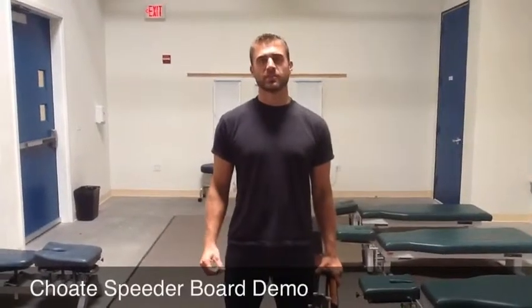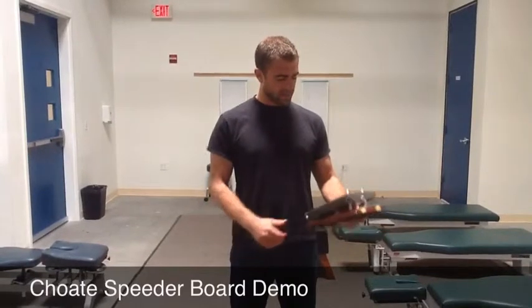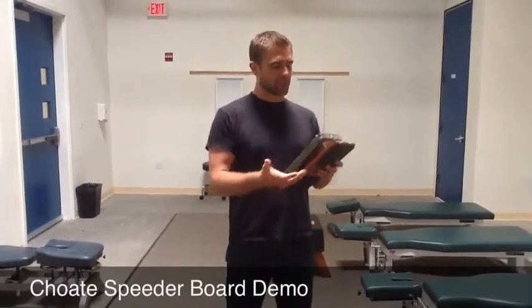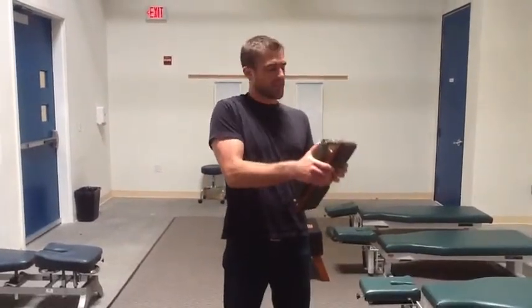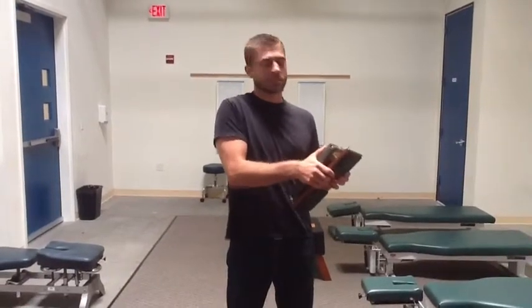Hi, my name is Chris Leninger from Life Chiropractic College West. I'm here today to talk to you about the Choate Speeder Boards. Choate Speeder Boards are basically an adjustment simulation tool. They're used to simulate an adjustment and simulate the way the bone actually feels when it drops when you make the adjustment itself.